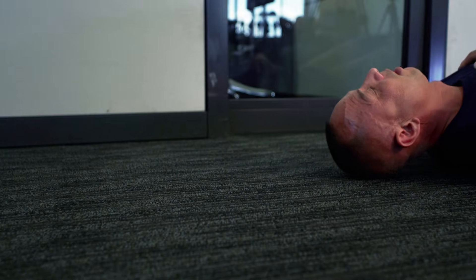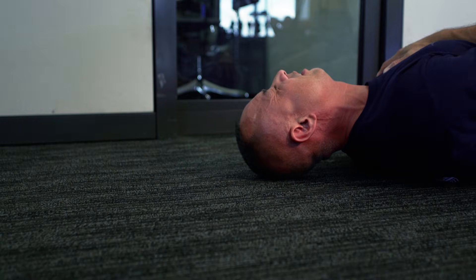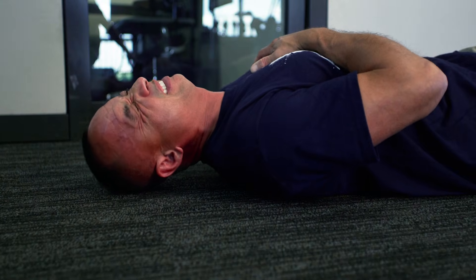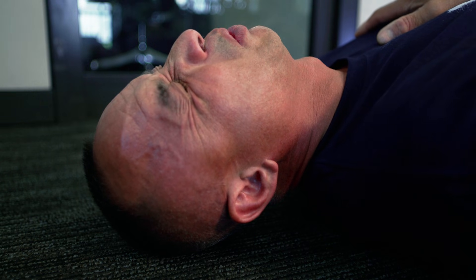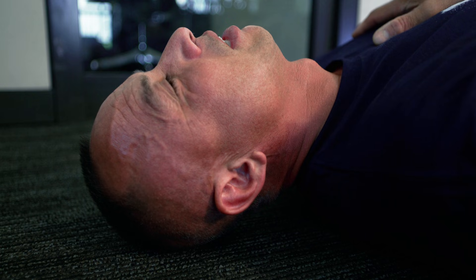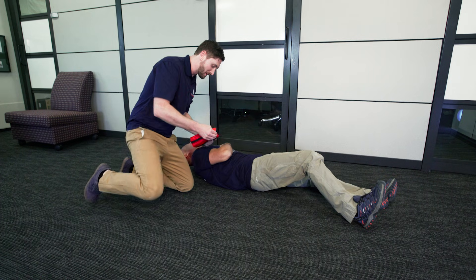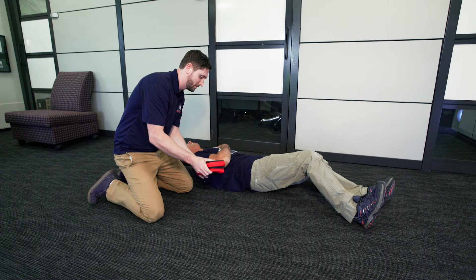Life-threatening bleeding warrants immediate intervention. Basic bleeding control actions provided by bystanders can often make the difference between life and death. The items in this bleeding control kit empower anyone to assist in life-threatening situations. Now you can easily prepare yourself for the unexpected. Lives are depending on it.